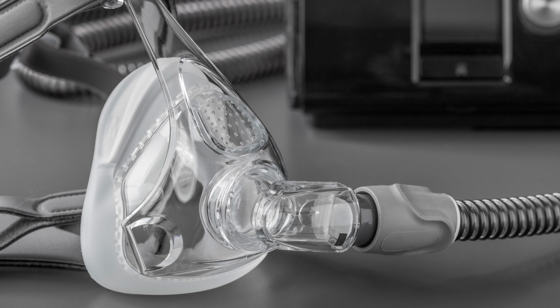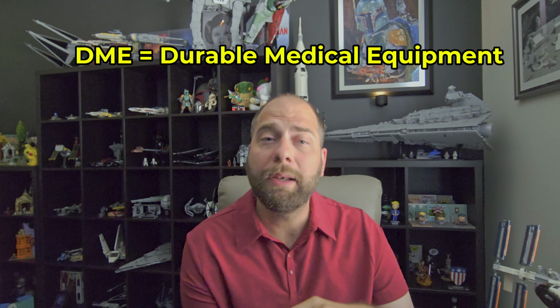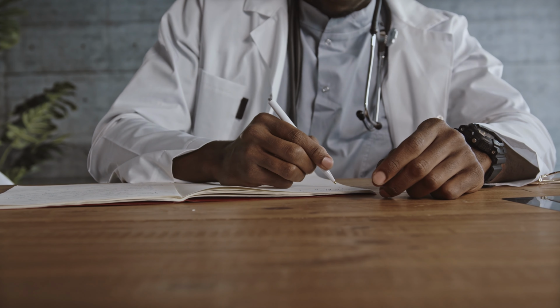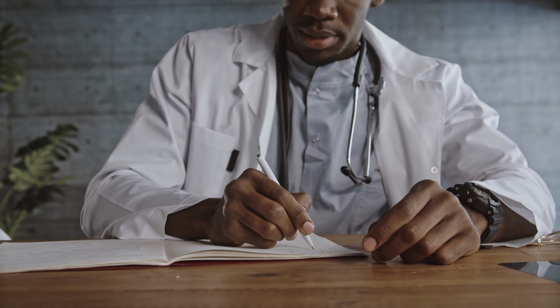Obviously a full face mask would be beneficial in that case, because if your mouth comes open, the seal's not broken, and thus there's not a lot of increased airflow. You can use chin straps with that. There could also be some settings on your CPAP machine that they could tweak to help that out, such as Flex or EPR. So I highly suggest you reach out to your DME company where you got your CPAP device, or your provider, to talk about these things and see if you can get this corrected, because this can really make your CPAP experience really negative. You're not going to be getting the treatment you need and deserve. It's not going to be going very smoothly.